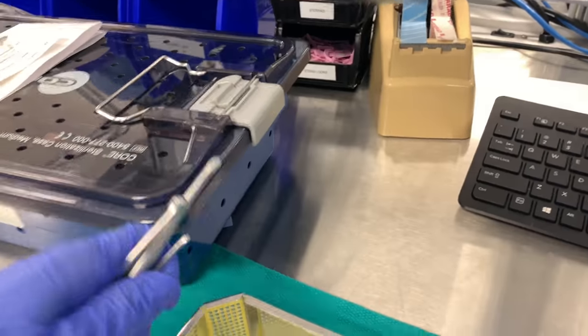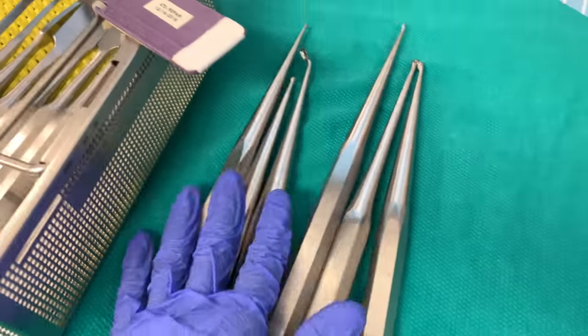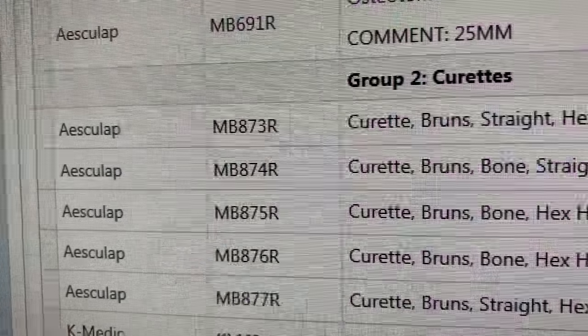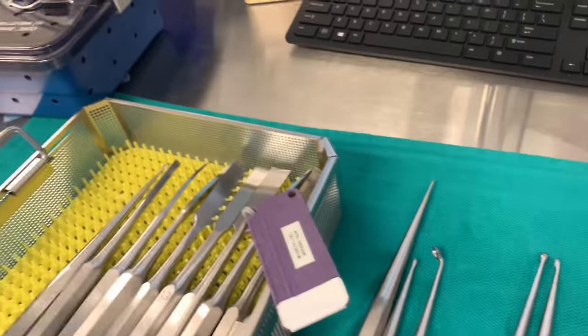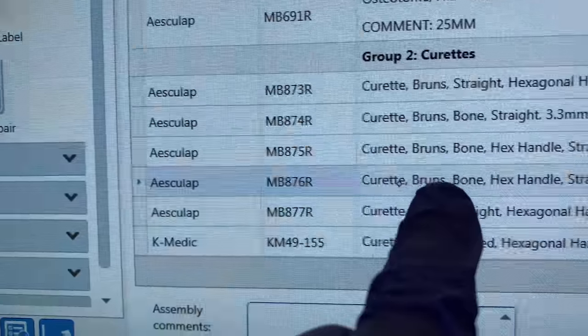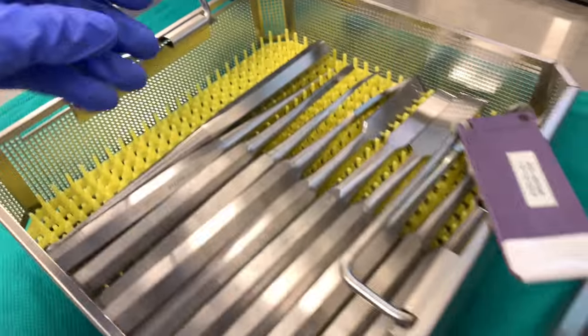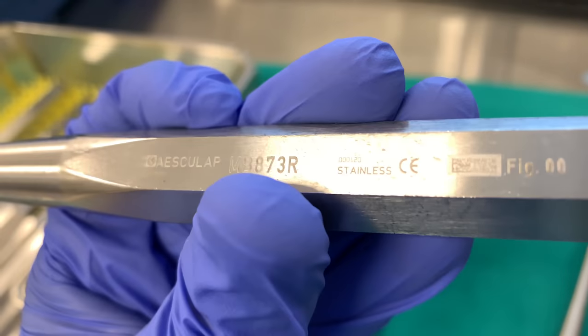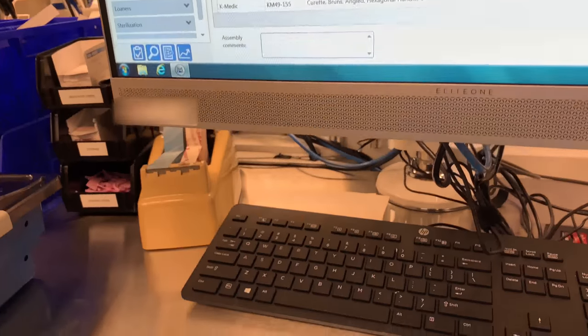Now we got our curettes. This one is 874 — right there, 874. This one looks pretty good. This one is 873R — 873R. It looks good too.